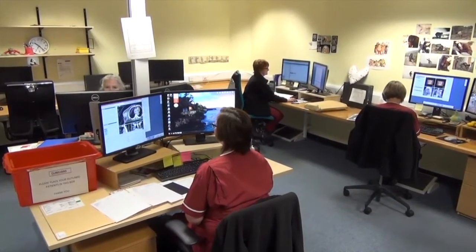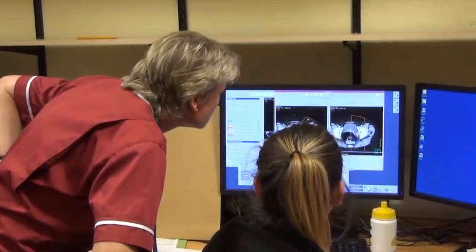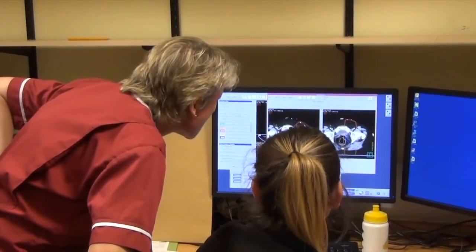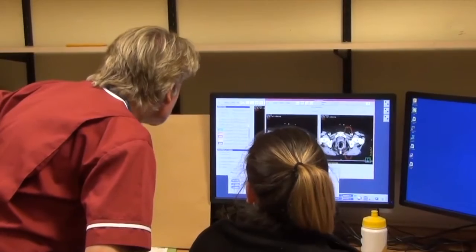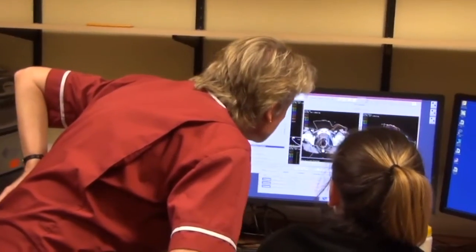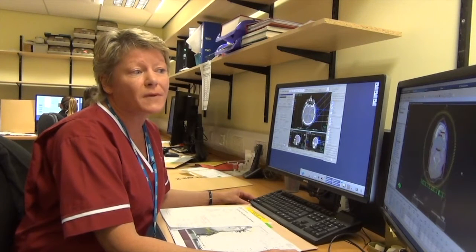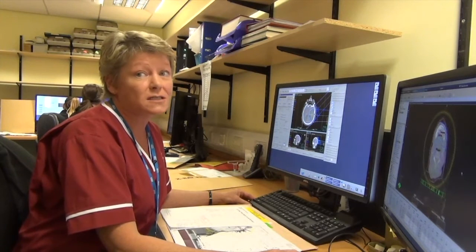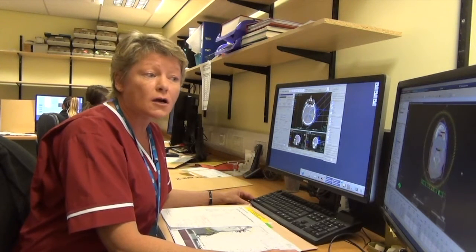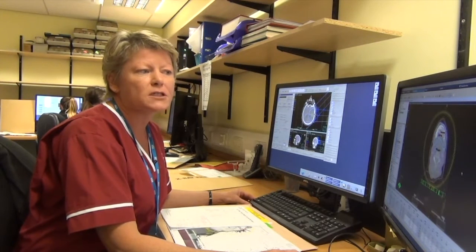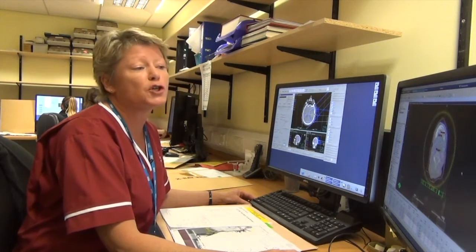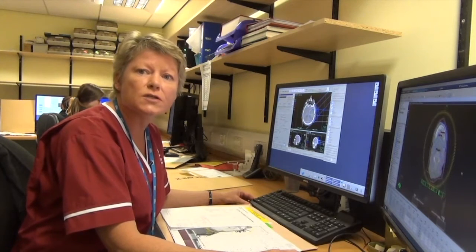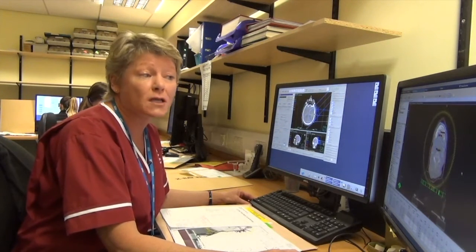Once prepared, the outlines are handed over to the planning department. Here, planning radiographers and physicists carefully work out a treatment plan based on the outlining completed by the clinical oncologist. This is an important part of the planning process because it enables protection of organs surrounding the tumour site — in this case particularly the spinal cord and the parotids. It also enables arc treatment, or VMAT treatment, to deliver conformal dose to the tumour site, which means the dose provided to the patient can be increased.